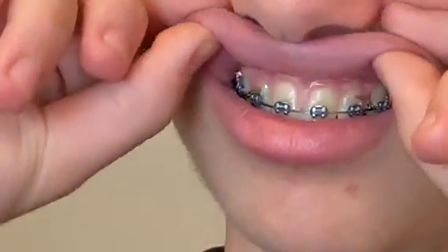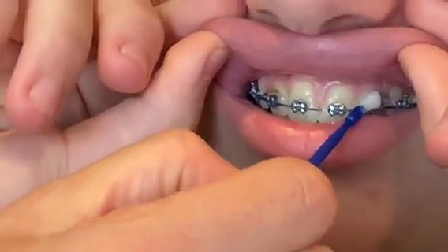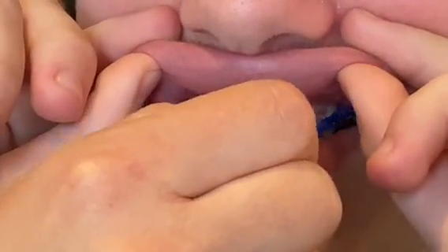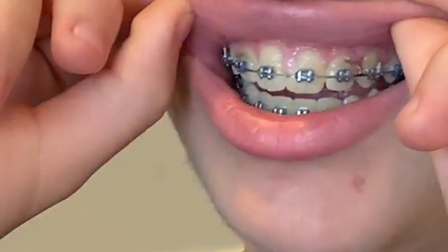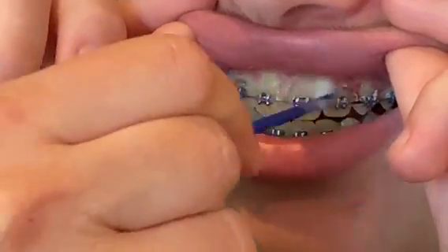Then your child's going to lift up his or her lip. You want to put it between the brace and the gum line, so you're gonna just apply it to this area. Open a little bit — try to get all the way back. It's gonna taste kind of like — this one's minty, but the consistency is like honey.